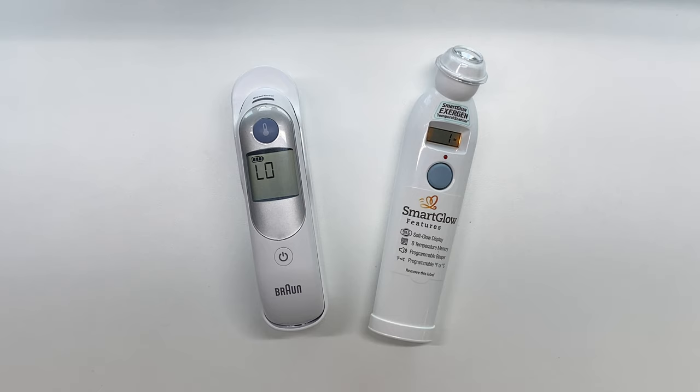What is going on guys? Today I want to do a quick product comparison between the Braun Thermal Scan and the Exergen Temporal Scanner. These are some of the most highly rated thermometers on the market right now. The Braun has been rated number one by pediatricians and the Exergen has been proven to be the most accurate in over 70 clinical studies.